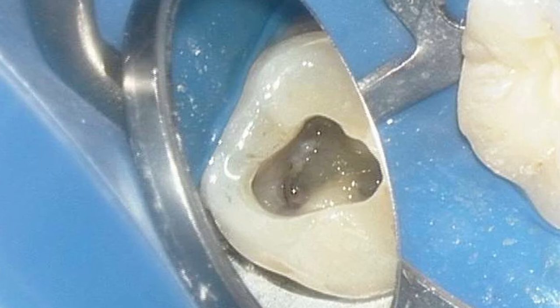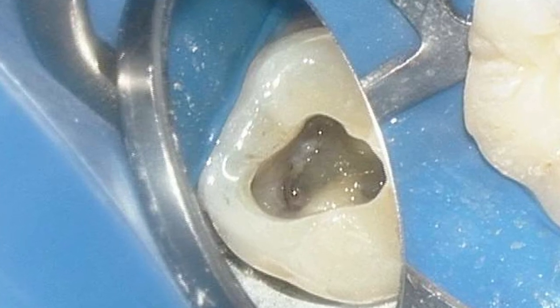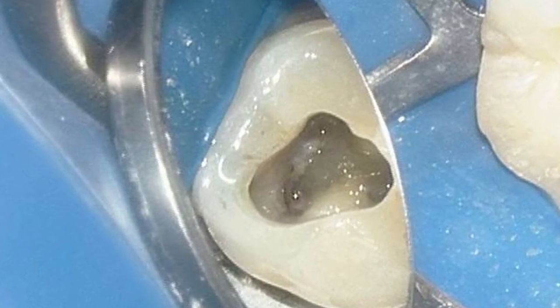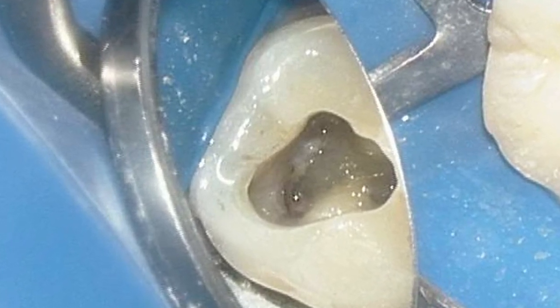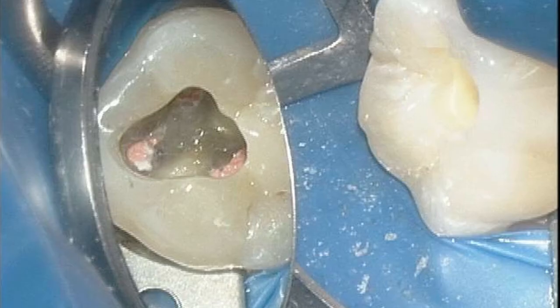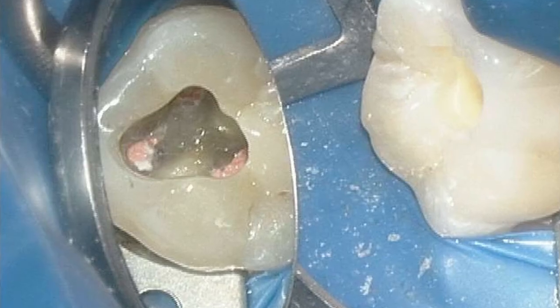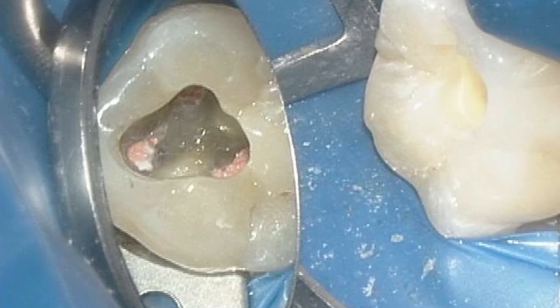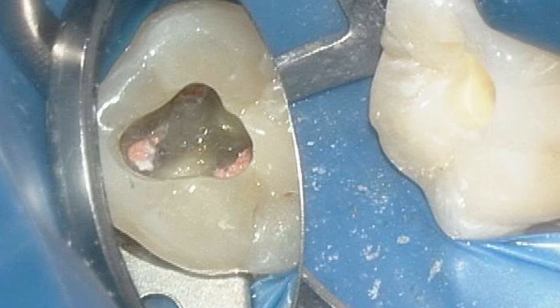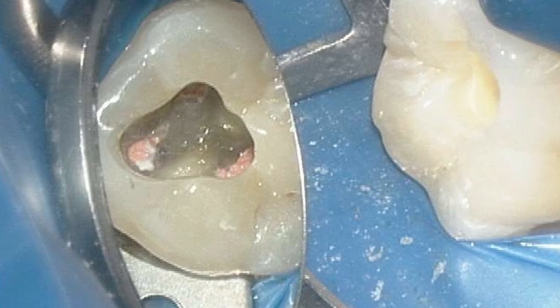Endodontic therapy was then performed as described in previous tutorials using the EndoSequence 04 taper NiTi rotary files and its corresponding obturation system using the bioceramic sealer and the active gutta-percha.